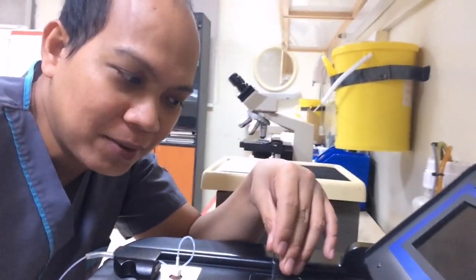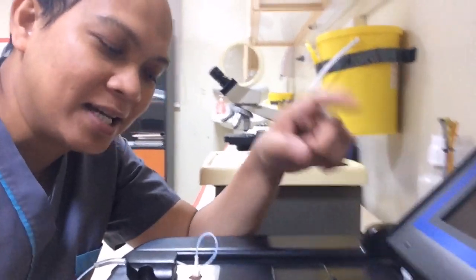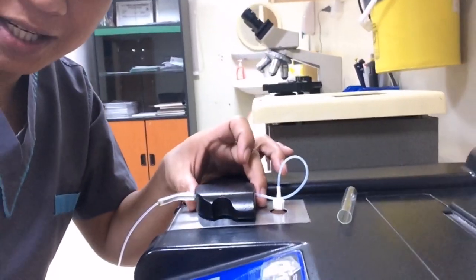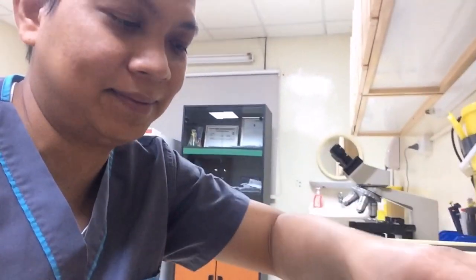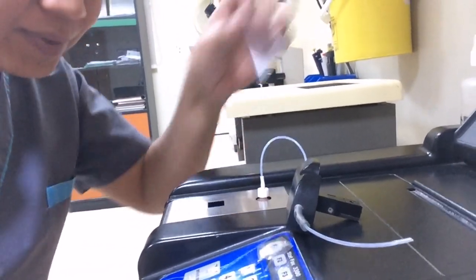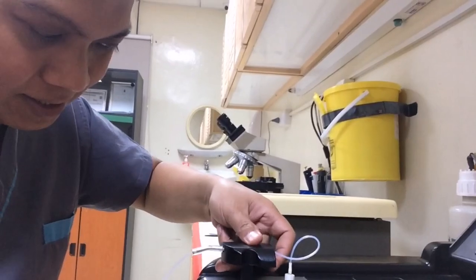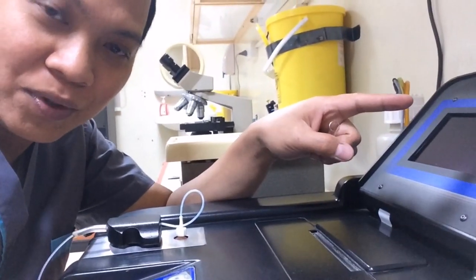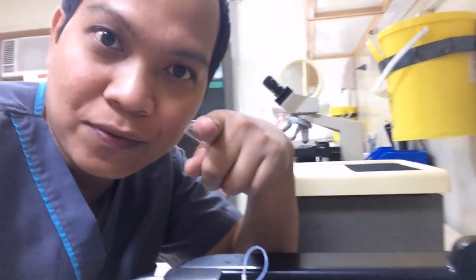Guys, this video is for laboratories having the same machine, STATFAX 3300, and encountering the problem of high vacuum, and also using a flow cell, because this machine you can also use with the tube method, like this one. If you are using tube, then no need for vacuum. But if you're using the flow cell, definitely you need vacuum. So if you are encountering this high vacuum error, this video is for you guys.